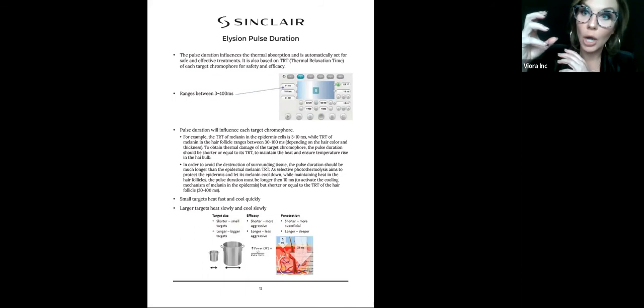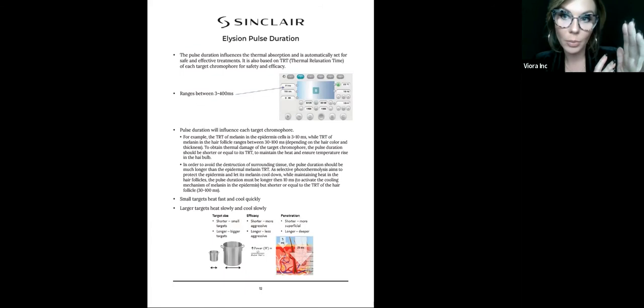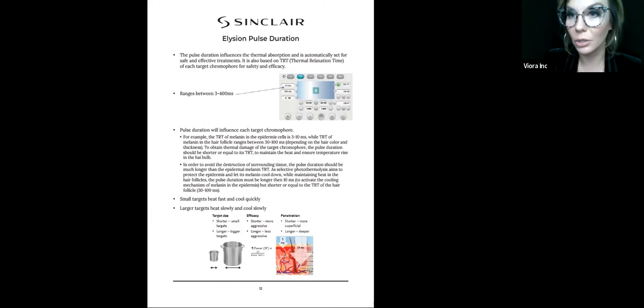Your dark, dense, coarse hair is your large stock pot of water. It holds onto heat and it attracts heat very easily. So you will be using a longer pulse duration for that and a much shorter pulse duration for your lighter, thinner hairs. You don't have to worry about this though. It's preset, which is great.